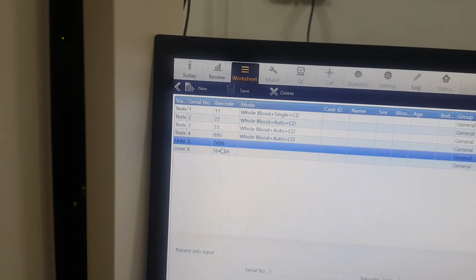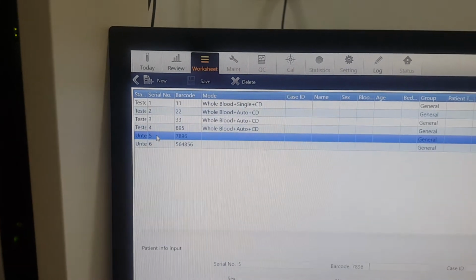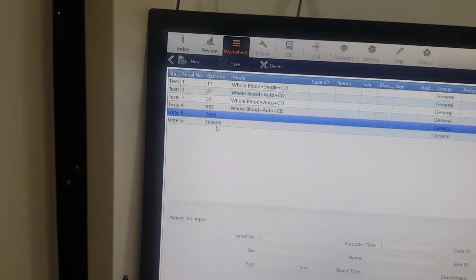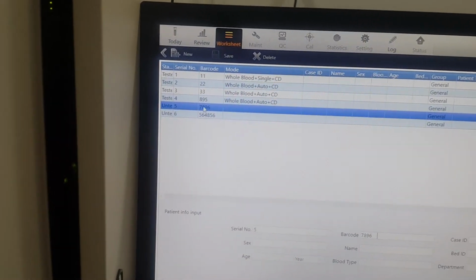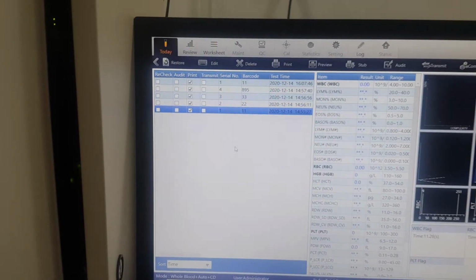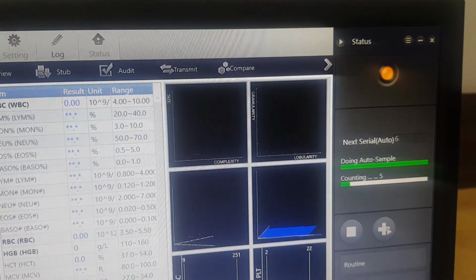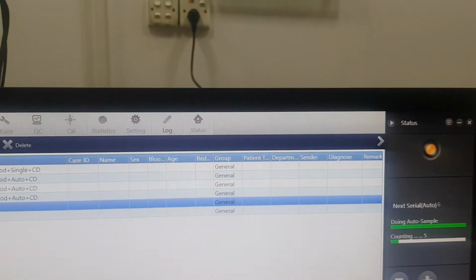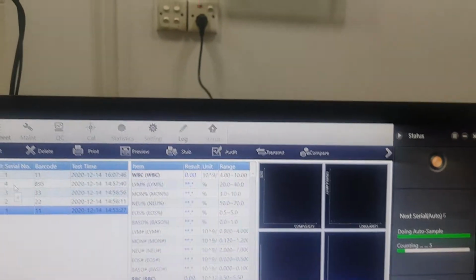So in the general case, when we run manual, it should analyze serial number 5, but it did not analyze serial number 5. It analyzed number 1. Now when we run in rack mode, we have 2 work lists empty, so the analyzer should analyze these 2 samples, but in reality it will make a new serial number and a new barcode. So this one is running. See, now this one is counting number 5. This is not counting actually number 5 according to the serial, because as we have number 1, 2, 3, 4, so it is going to 5.